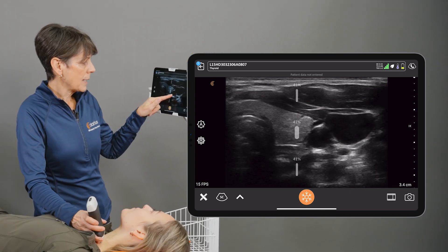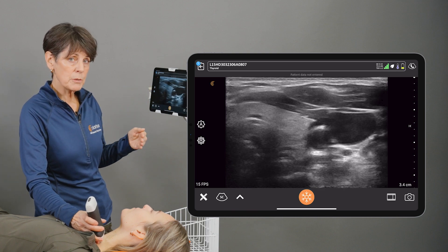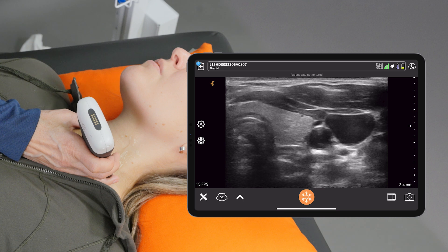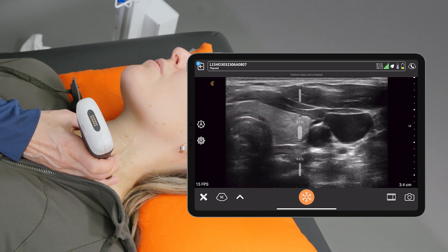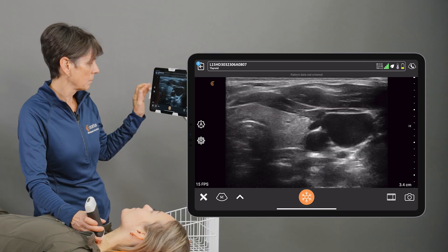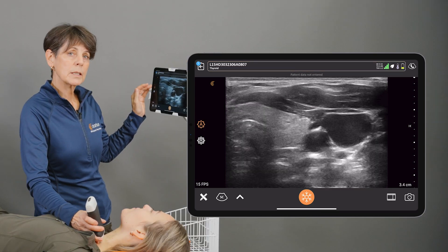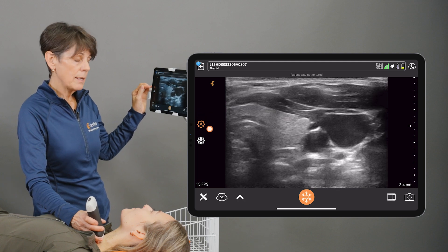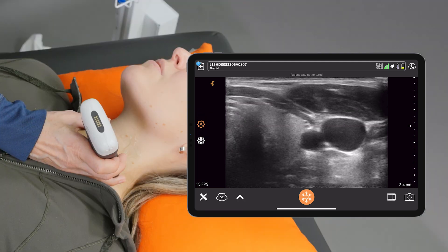By selecting the correct preset that will get you close to where you need to be with your gain settings, but adjusting the gain will optimize your image just a little bit better so that you can see things more clearly. On the Clarius app there's an auto gain setting that is adjusting the gain for you as you scan. Practice with that and optimize your image as best you can with the gain for better results.